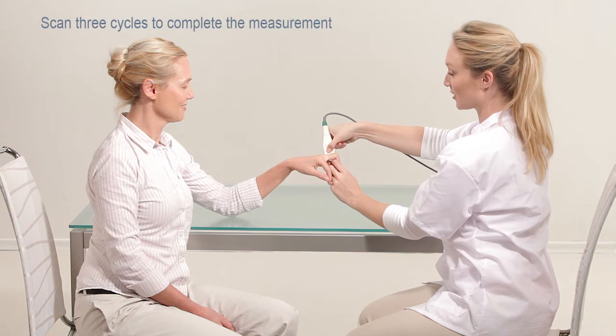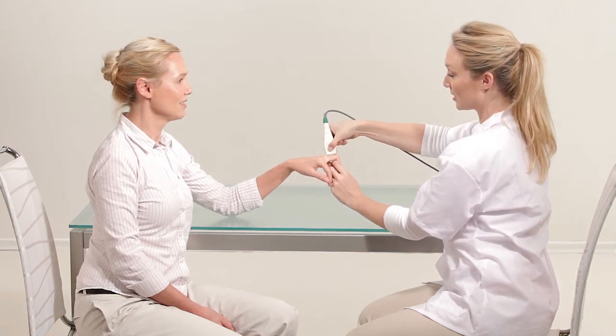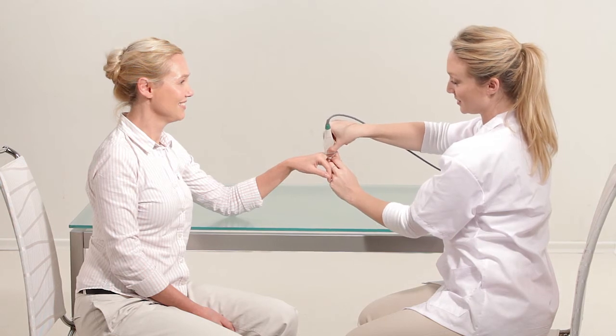Scan three cycles to complete measurement. If the information is insufficient, the system may prompt you to perform up to two extra cycles.